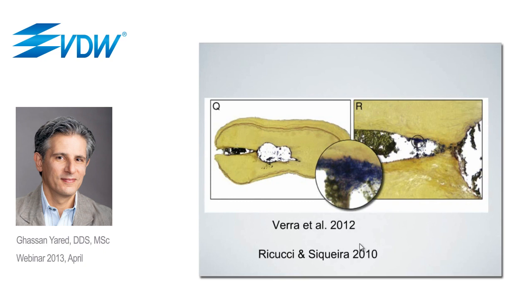There are questions also about the cleaning and the obturation of lateral canals. So this is a cross section made in a premolar. We know from many studies that no matter what we do, no matter what technique we use, the lateral canals of infected teeth will always contain bacteria, they will always contain necrotic pulp tissue, no matter what we do. So whether we're using single file reciprocation or continuous rotation, these lateral canals will always remain infected.